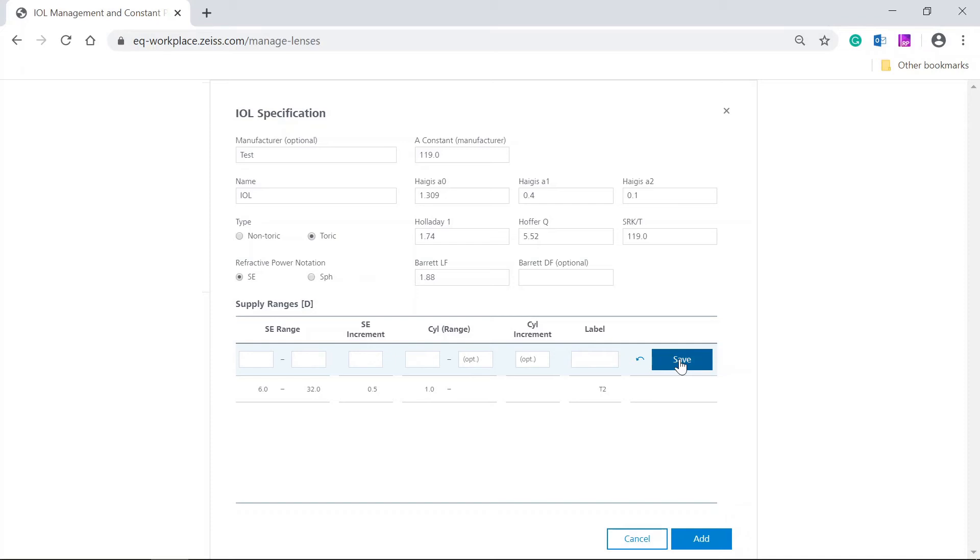See this delivery range appear in the list below. Let's add the next delivery range for this TORIC IOL.